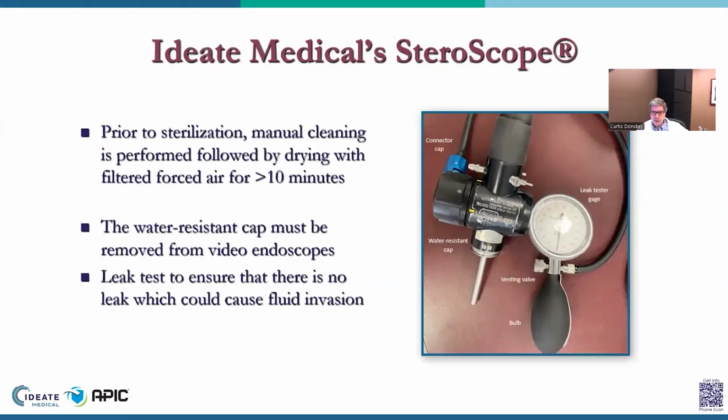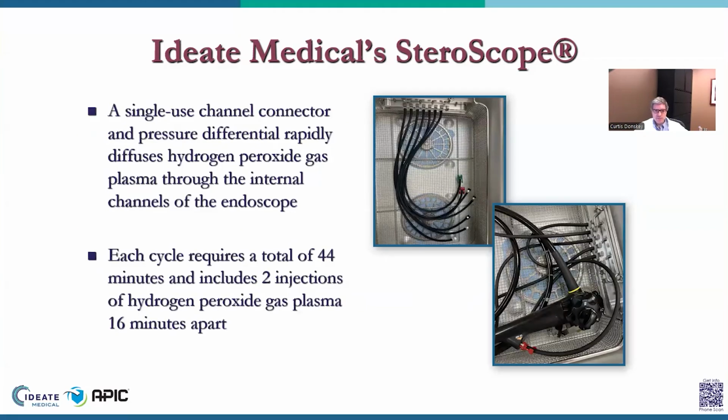So again, the device is shown there. And prior to sterilization, manual cleaning must be performed, followed by drying with filtered forced air for a minimum of 10 minutes. The water-resistant cap has to be removed from video endoscopes. And then we do a leak test to ensure that there's no leak that could cause fluid invasion. Next.